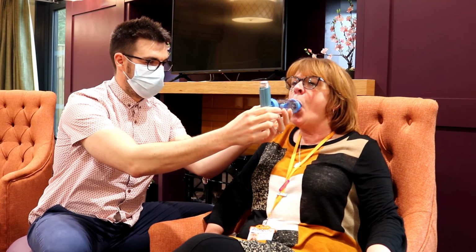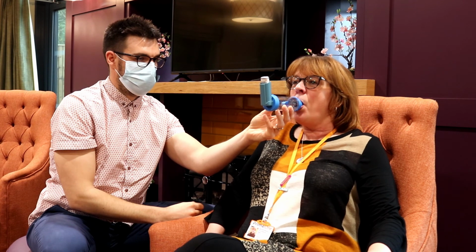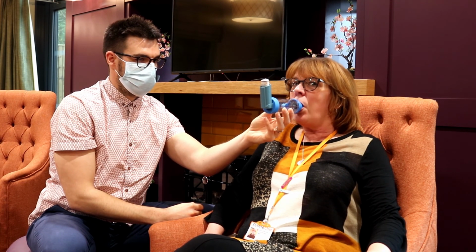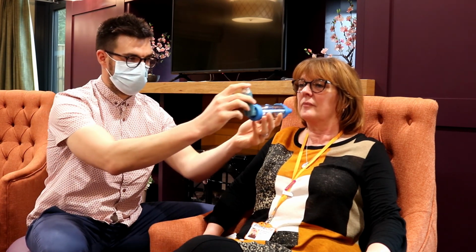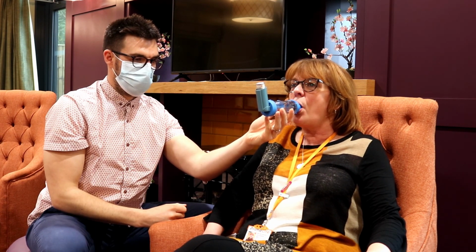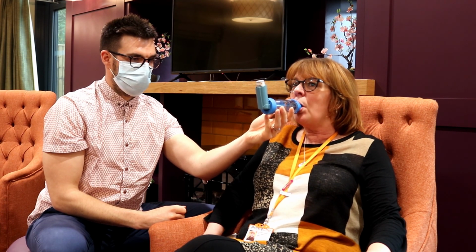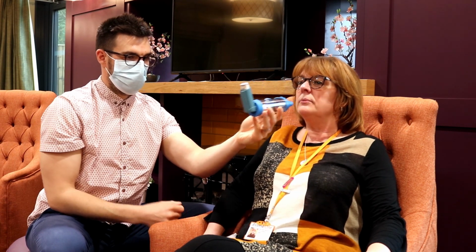Ideally, the person should be sat upright or standing when administering inhaler. When putting the spacer into the client's mouth, to ensure a good tight seal, it's advised the client is told to say "ooh" to ensure the lips seal around the mouthpiece. Between doses of the inhaler, remove the inhaler from the spacer and shake the inhaler twice. Following the use of a preventer inhaler, which is a steroid, it's advised that the person rinses their mouth with water and spits. Alternatively, they could clean their teeth afterwards. This is to reduce the risk of oral thrush.